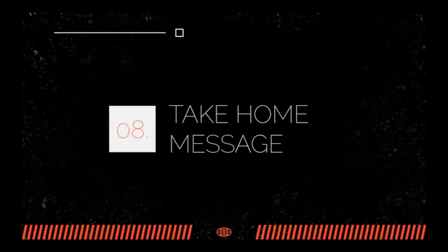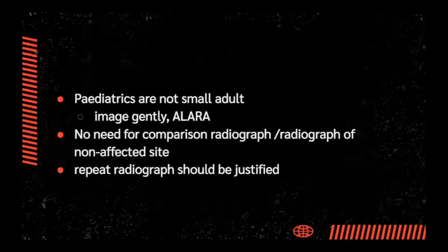Right, so we are towards the end of the session. Some take-home messages. Again, the famous quote is that pediatrics are not small adults, for the reasons I already mentioned earlier. So we need to image gently and adhere to ALARA, which is as low as reasonably achievable.